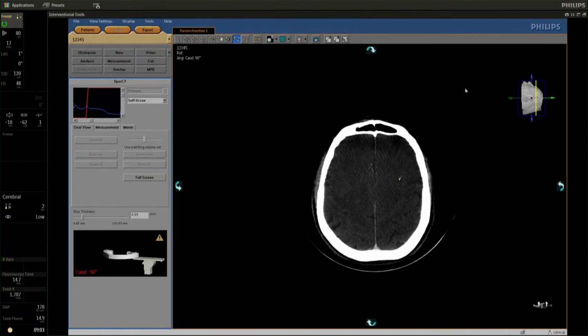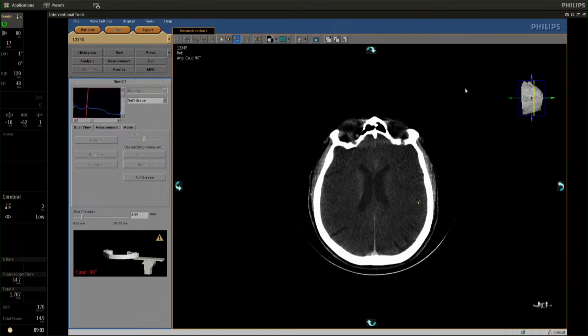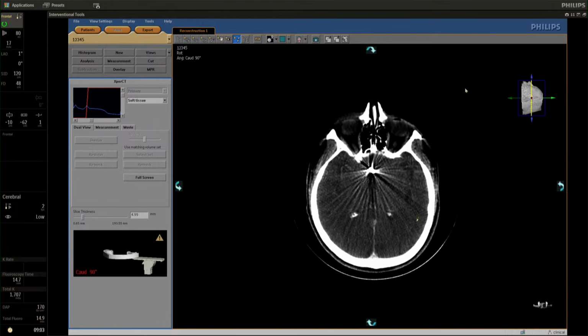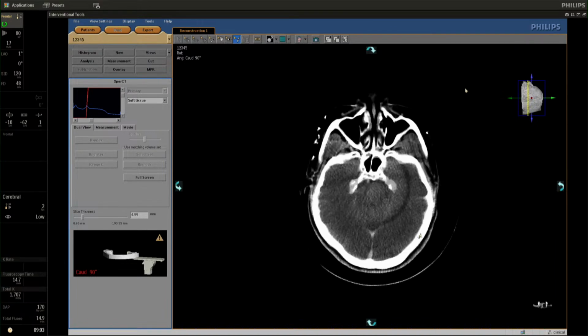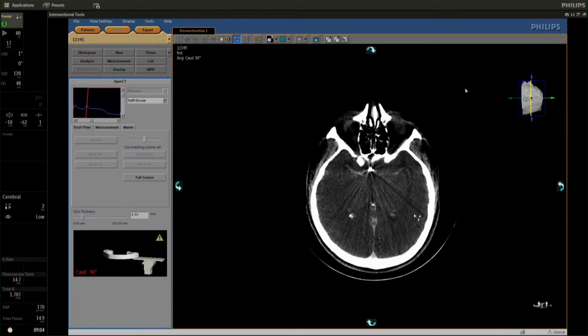Yes, the CT control is ready. This is contrast enhancement because of the flow arrest, I think, and the aneurysm level is clear. Now we can finish. And the next case would be in 30-35 minutes. Thank you. Have a good day.